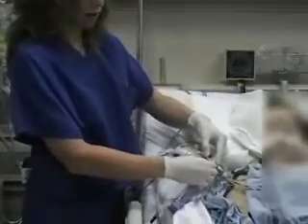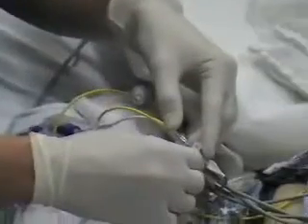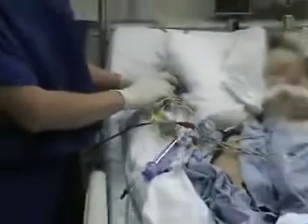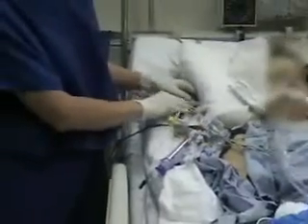Ideally, you should disconnect this. However, if you are doing serial hemodynamic profiles, it is better to remain connected than to risk breaking the closed system and exposing the patient to infection.